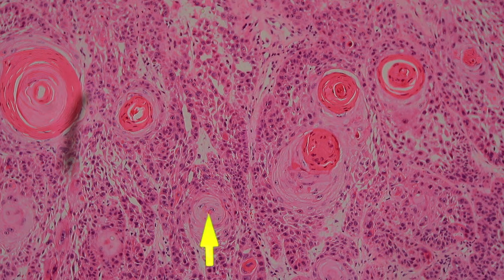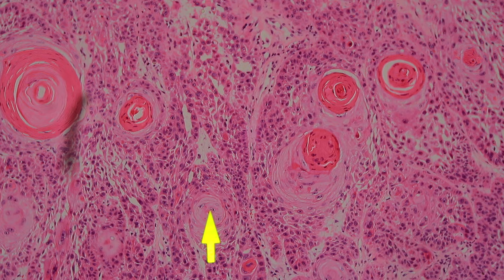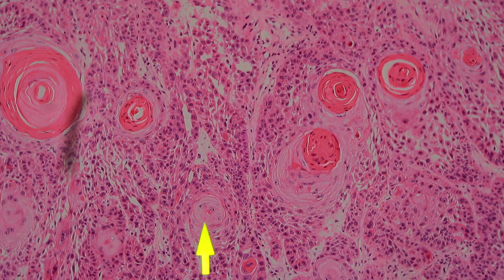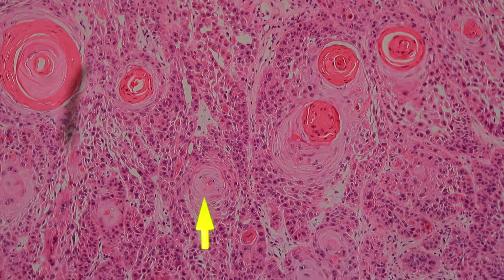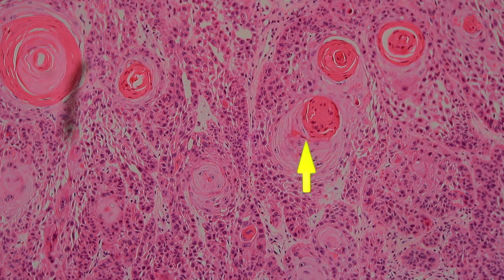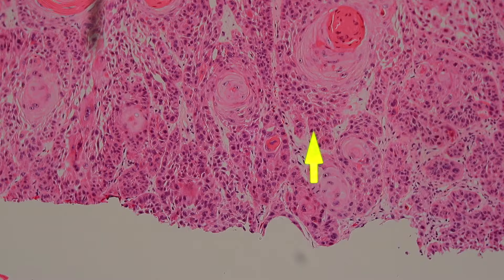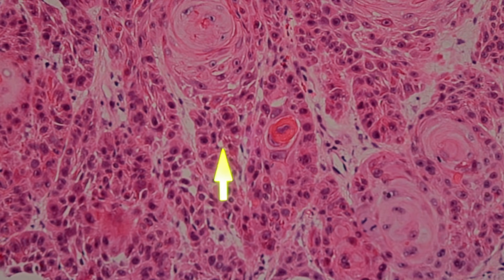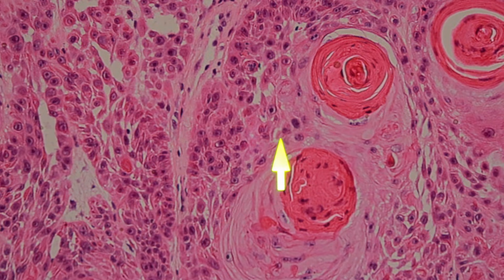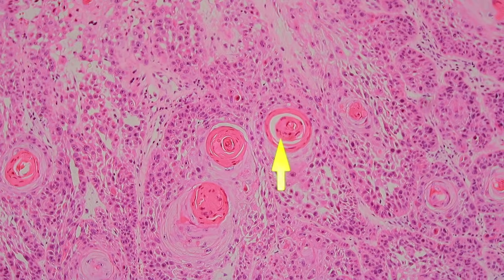You can see there's not much keratin really in the middle here except maybe a tiny smidgen, but these swirling keratinocytes are starting to produce. Even finding this kind of swirled, glassy appearance — we call that glassy — can suggest squamous cell carcinoma, even if it doesn't have well-formed keratin pearls. Because not every seborrheic keratosis has horn pseudocysts and not every squamous cell carcinoma has keratin pearls. Sometimes you see individual highly keratinized cells — see all the dense keratin in that cytoplasm? It's evidence the tumor is producing keratin, which in a malignant tumor suggests squamous cell carcinoma.